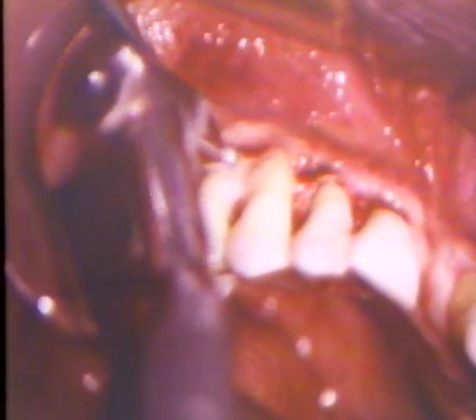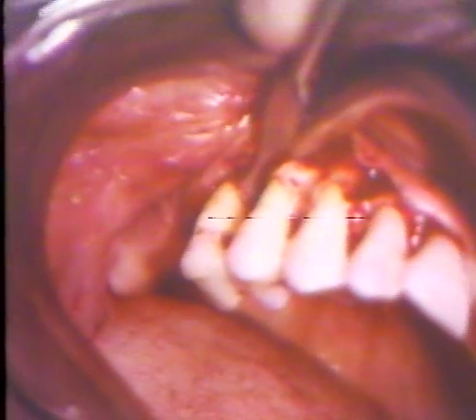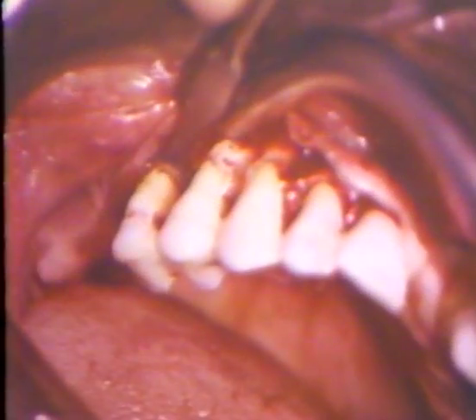Accentuation of the interdental septum is also accomplished between the canine and the first premolar. This will be repeated in other areas. Debris and fragments are removed with a curette. The bone chisels enable the clinician to create physiologic architecture in this premolar region. Curettes again are repeatedly used to remove any loose fragments.